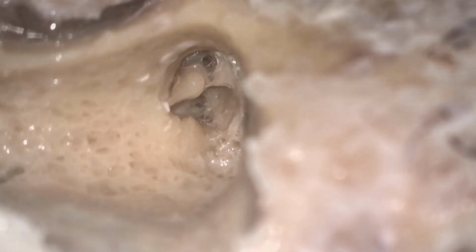Okay, so now you are visualizing the ventilation fold that divides the anterior and the posterior epitympanic space and holds the ossicles. Basically the ossicles are suspended from the tegmen by these ventilation folds. So this is the ventilation fold.